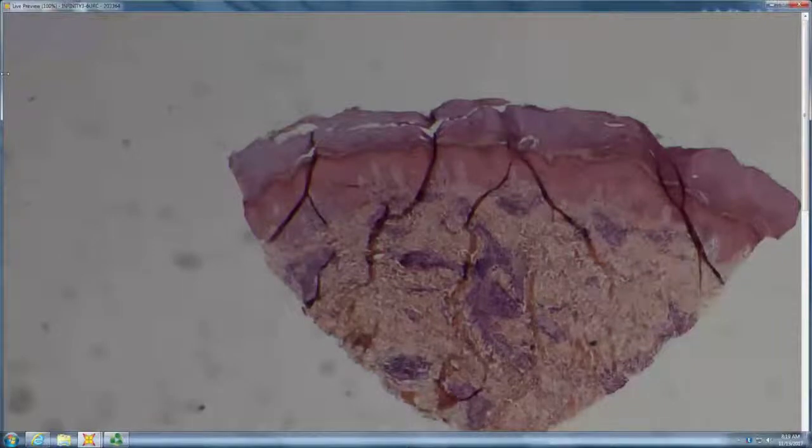No. Yes. You tell me. Is this likely Still's, yes or no? There's karyorrhexis. No. That's not so Still's, right? Still's is the neutrophilic disorder that's like urticaria, where there's no karyorrhexis. When you've got karyorrhexis, you're probably vasculitic.